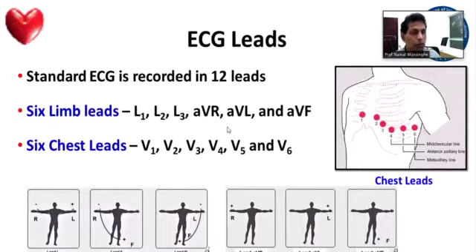Because you may be posted to a faraway hospital, in a place where there is no ECG technician. So please remember the way you do the ECG, and also the ECG machines may be different from place to place. So just play with your ECG machine when you start your internship and get to know how to do an ECG, especially in an emergency.